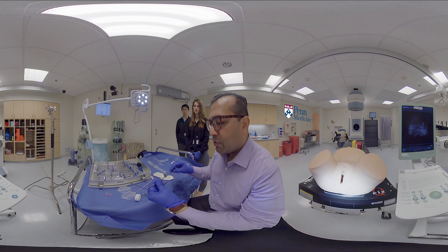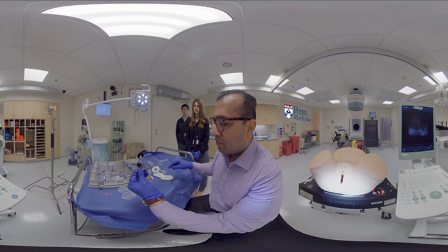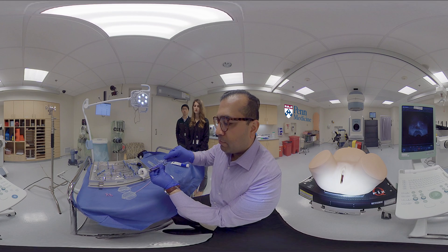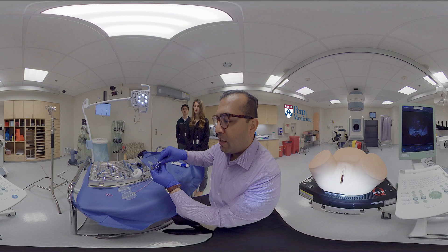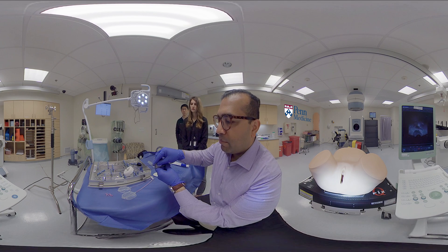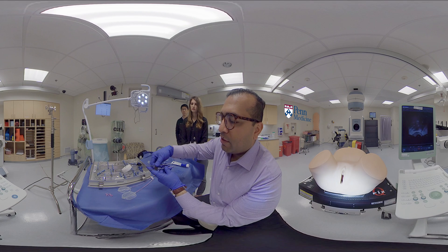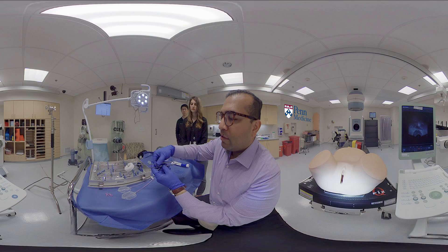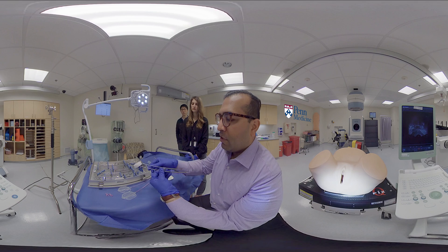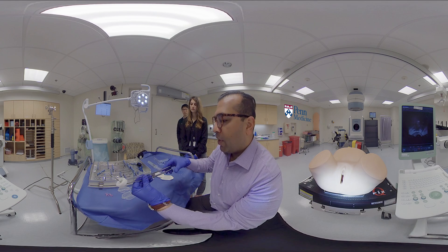After placement of the intrauterine tandem into the patient, to place the ring, the ring is slid over the intrauterine tandem and then rotated into place, advanced forward on the intrauterine tandem, and then locked together using the side screw. This is a fully assembled, now rigid, tandem and ring.